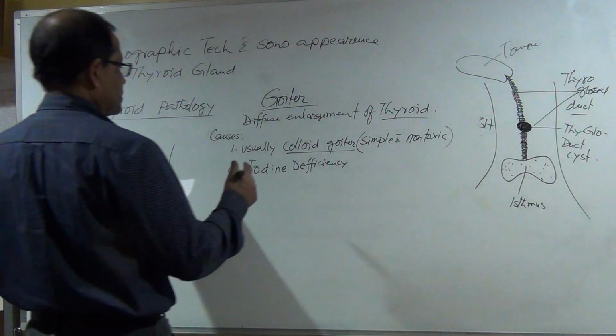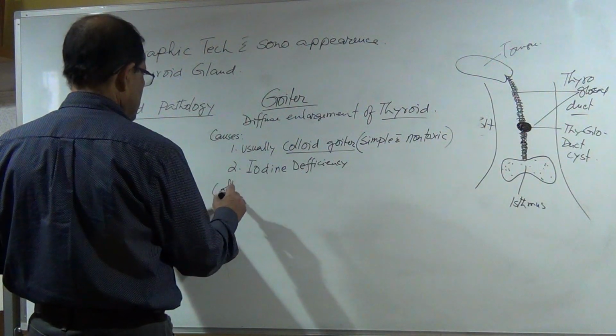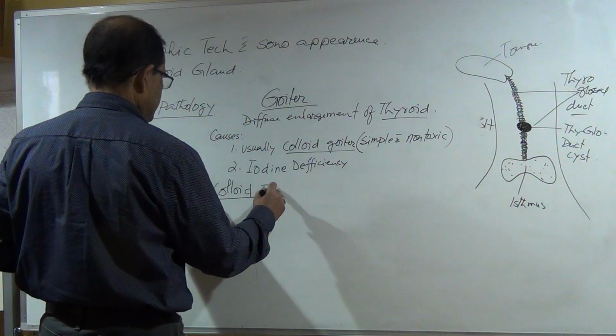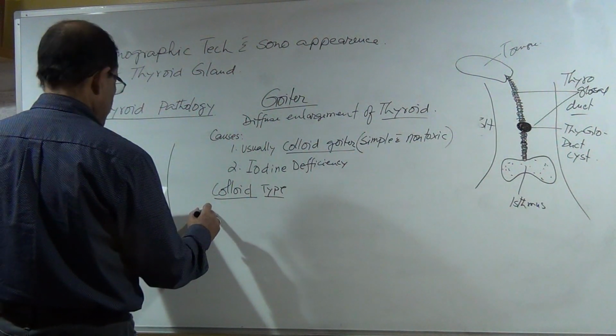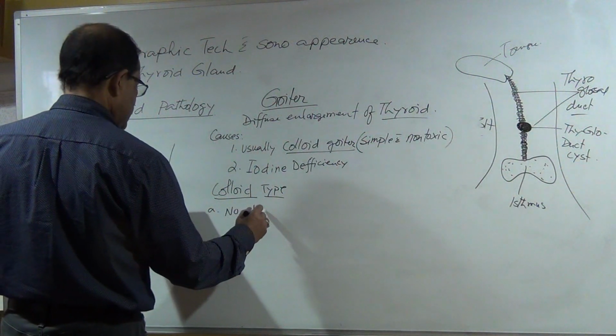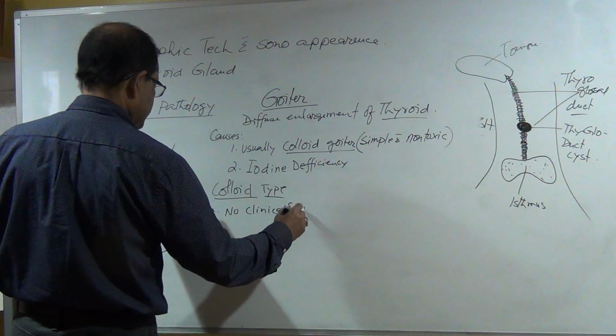That means the colloid type has no clinical significance.